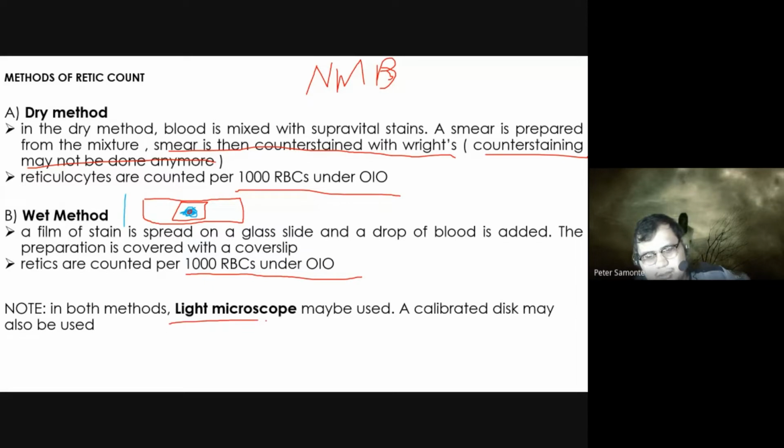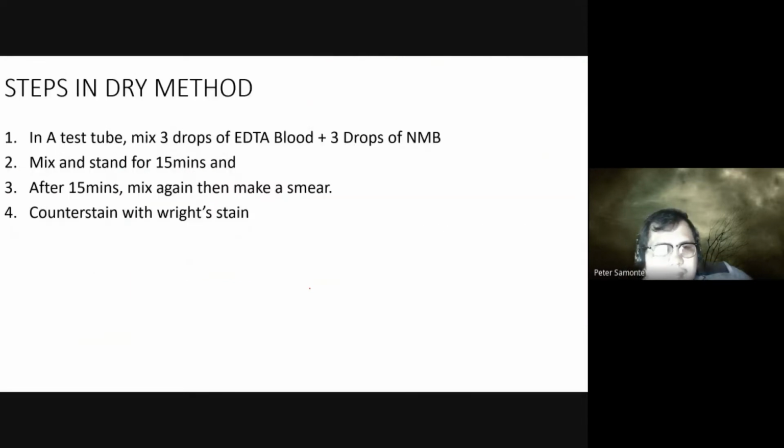In both methods, a light microscope may be used. A calibrated disc may also be used. So, ituturo ko yung calibrated disc later. So, now let's proceed to your dry method.